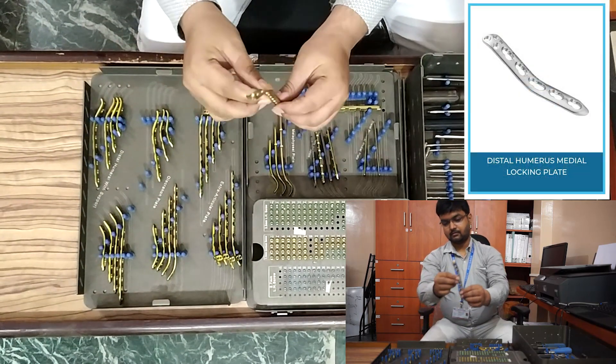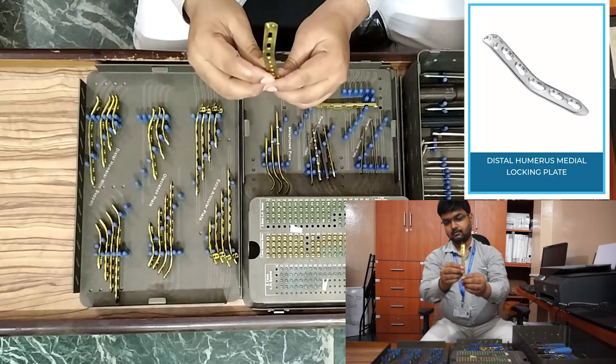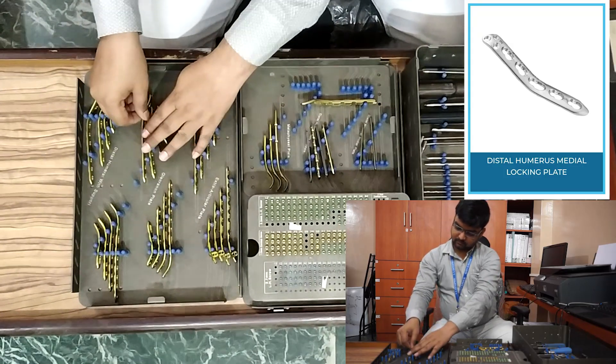Next, distal humerus locking plate medial plate. This also comes in left side and right side, in three-hole, five-hole, seven-hole, and nine-hole configurations.